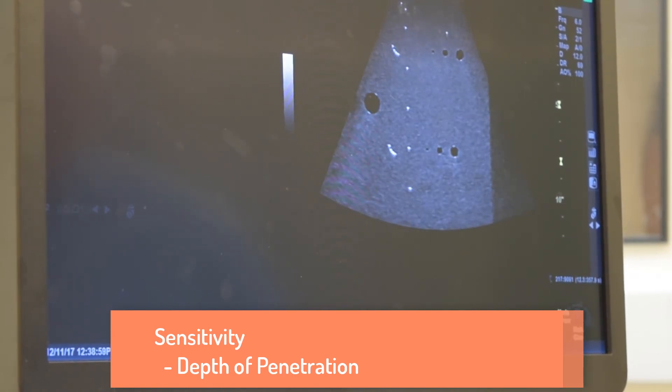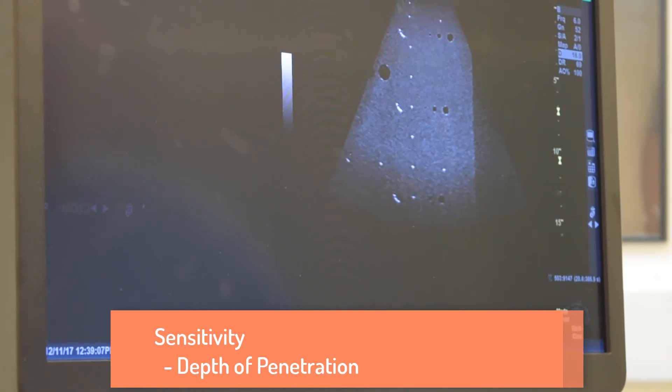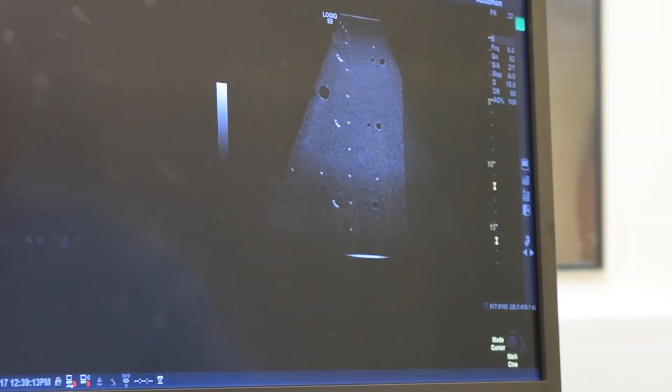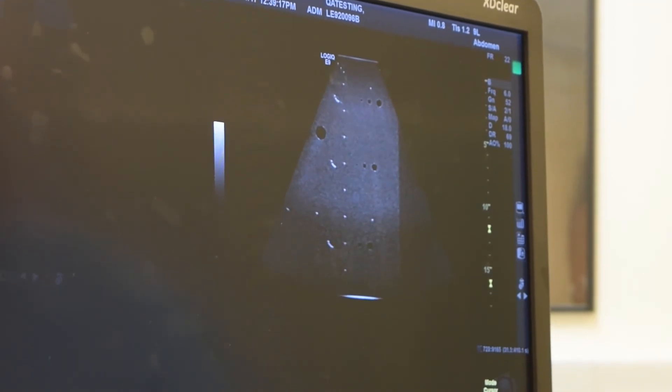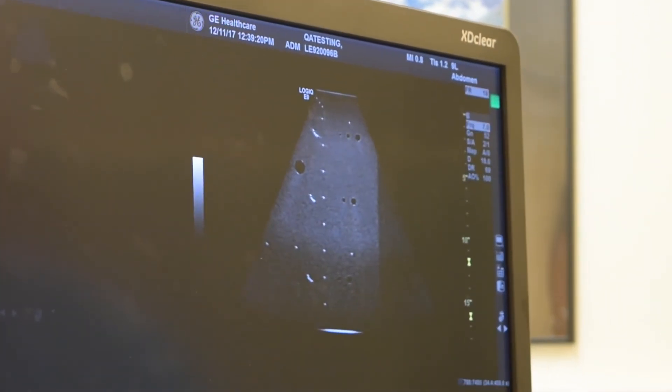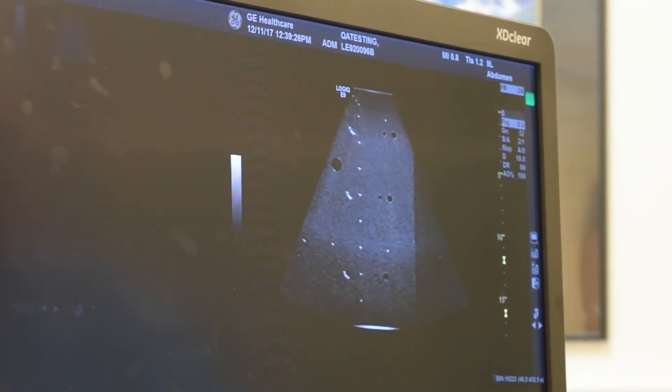A third test done during each survey is to check on the overall sensitivity of the scanner. This will be done using a depth of penetration test. We set the image field of view to as large a depth as possible. Set the output transmit level to a hundred percent, which is the typical setting for most scans, but do check and make sure it is a hundred percent. Set the gain so that you can just barely see noise, and then adjust the frequency, which we're changing here, so that it's in a mid-range of the frequency ranges available on the machine.